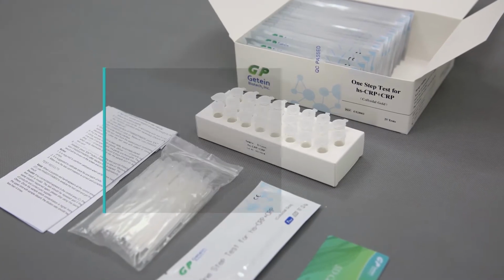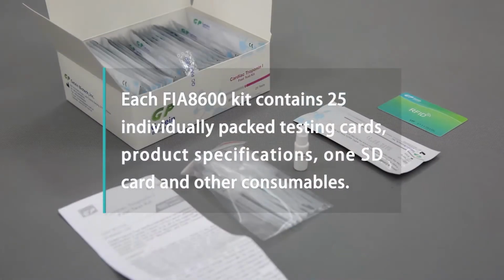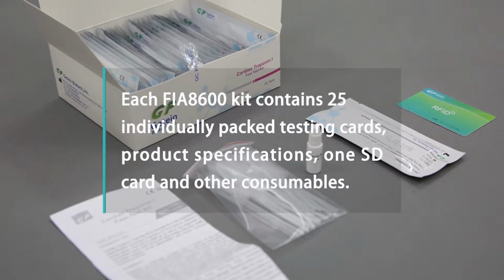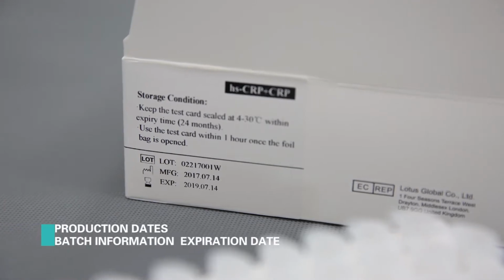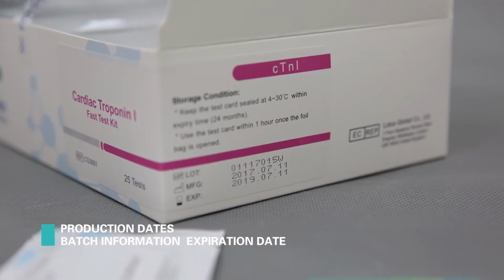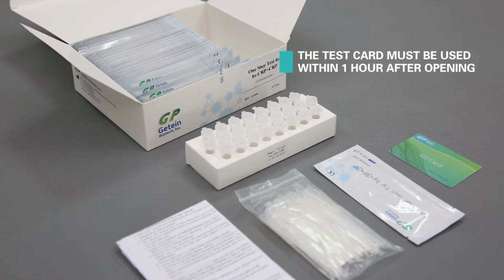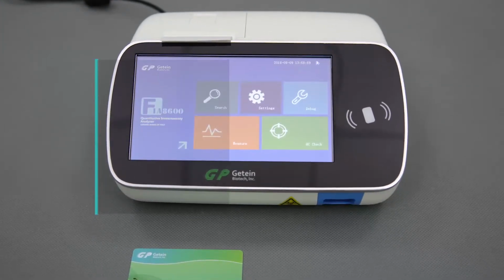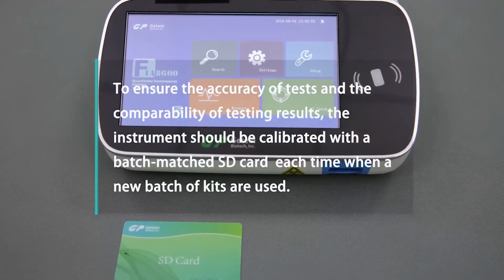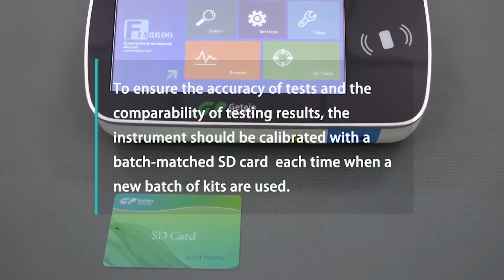Each FIA8600 kit contains 25 individually packed testing cards, product specifications, one SD card, and other consumables. Production dates, batch information, and expiration date are labeled on the side of the packaging box. The test card must be used within 1 hour after opening. To ensure the accuracy and comparability of testing results, the instrument should be calibrated with a batch-matched SD card each time a new batch of kits is used.